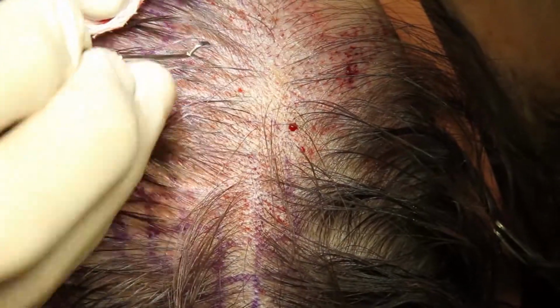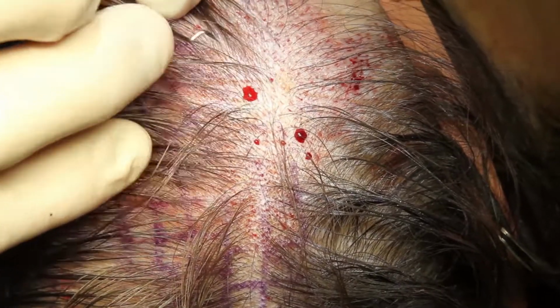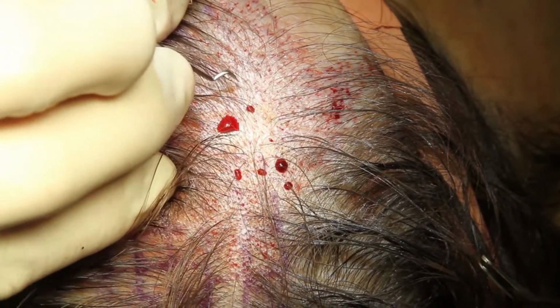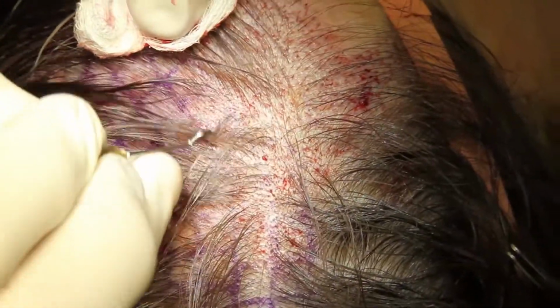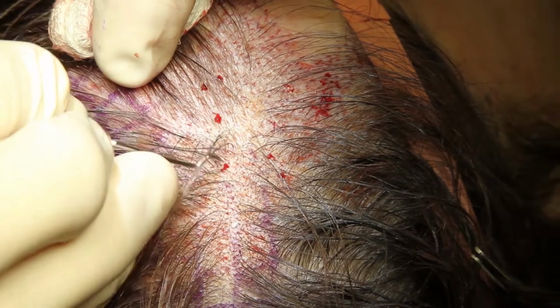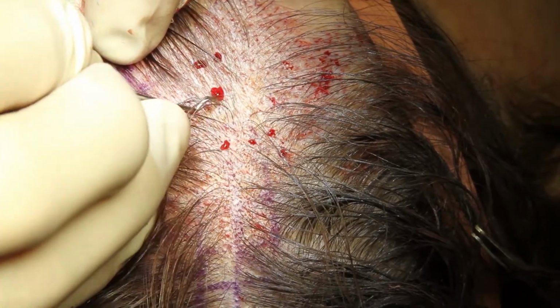So that's really the key to the grafting, is proper placement of these little tiny slits. And then ultimately we're going to be placing each one of these little micrografts, and once these start growing, you can't tell the difference between the hairs that I've placed in these little tiny slits and the natural hair that's growing on his head right now. So I'm saving every one of his natural hairs by carefully placing this between those little hairs.